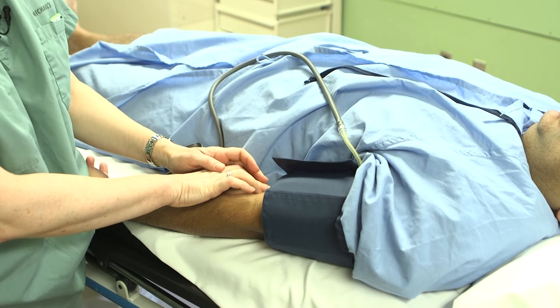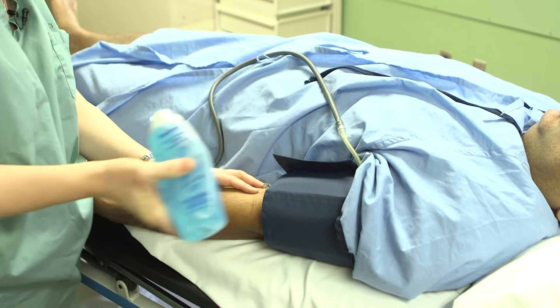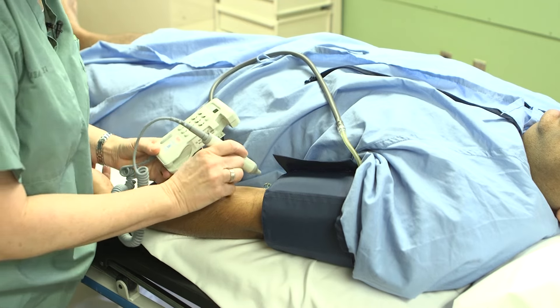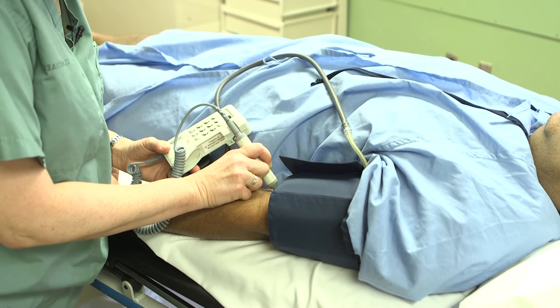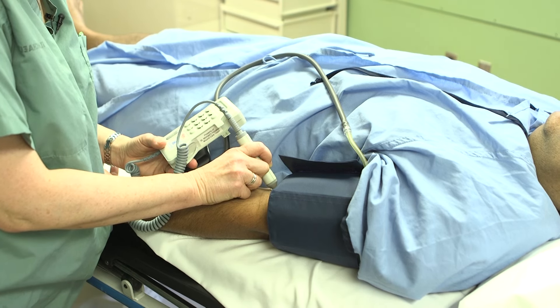Touch the brachial artery here. Then using your handheld Doppler, we're going to listen for the brachial pulse and its signal. You can clearly hear the brachial artery signal.